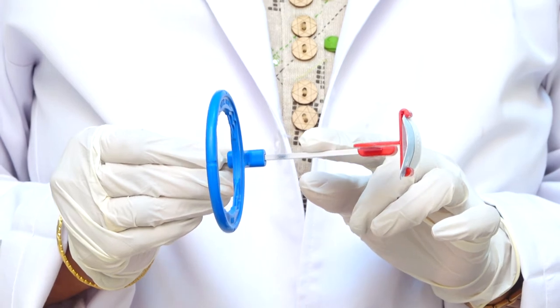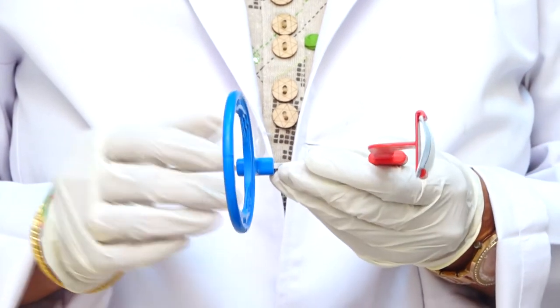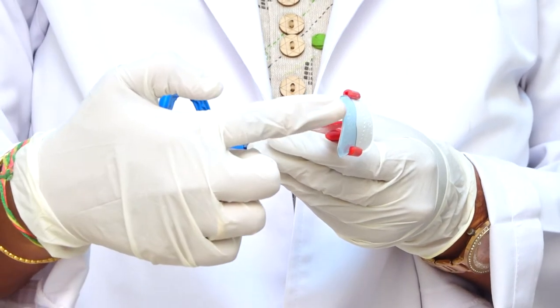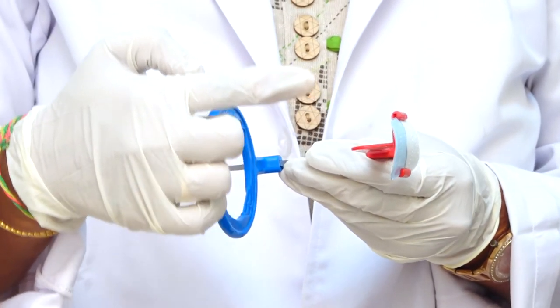This is the XCP instrument for bitewing, where we have an external guiding ring, a bite plane, and a size two film. Let's take a demo on the patient.